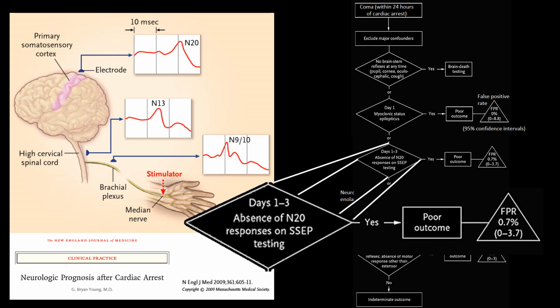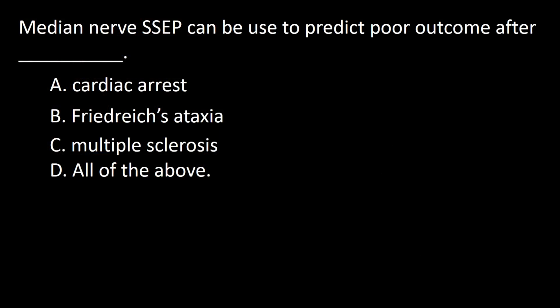So, for our purpose, the important thing is that patients with absence of N20 1 to 3 days after a cardiac arrest have poor outcome. So the answer to this question is A.